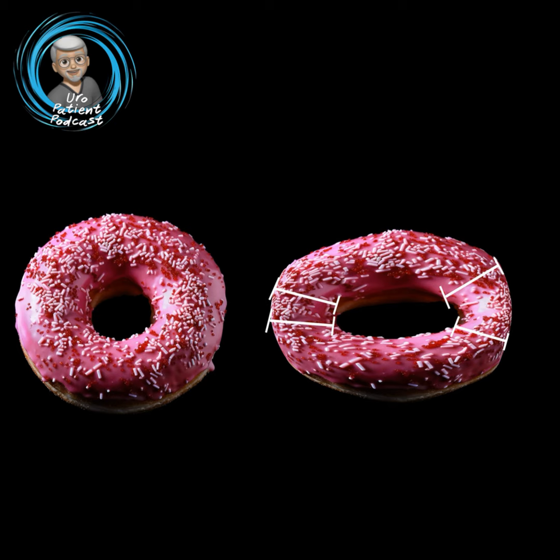It's basically, as you can see, the scope goes into the prostate and fires these little compression implants, they call them. They're like a suture with, I call it staples, with little staple ends on the end. And it pulls open the prostate like you see in step 3. Now, I do have a video from the company. I think that clears things up a lot more. It shows a little animation of how it's done. I'm going to play that for you right now.